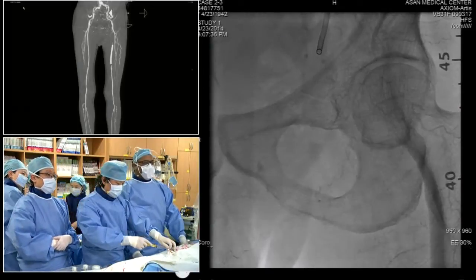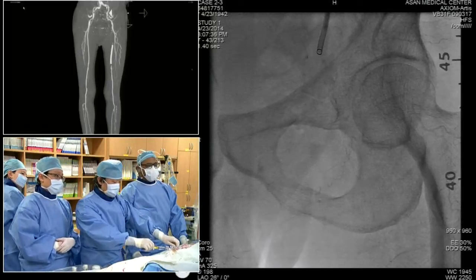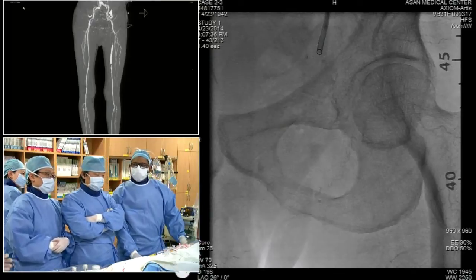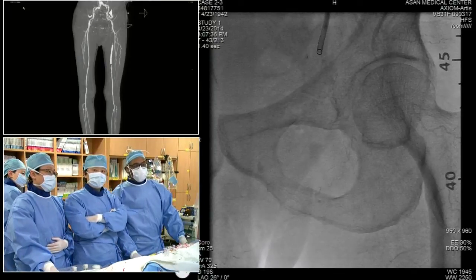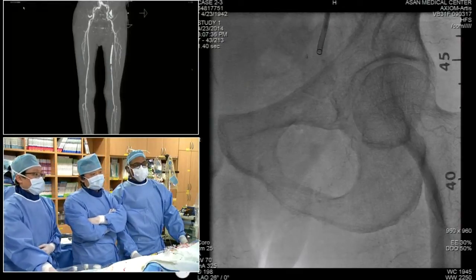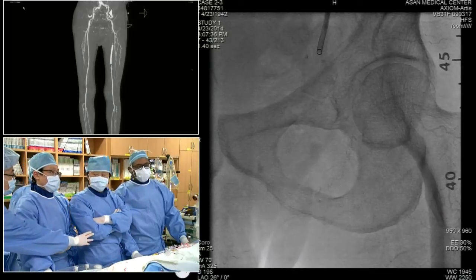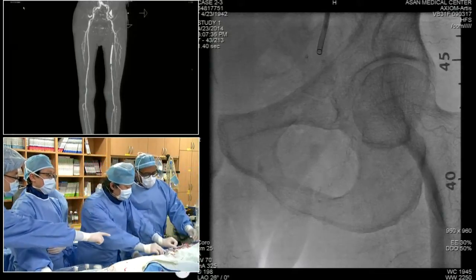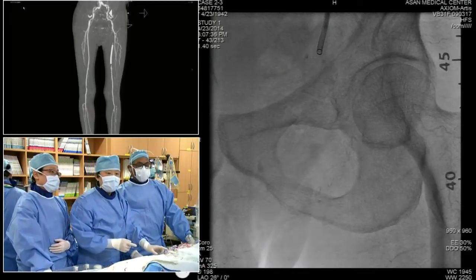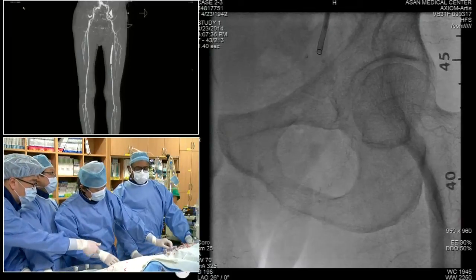I think backup in dealing with a long CTO is very, very important. Obviously, we want to get in the same plane as that nitinol stent, and that's going to be key. If we get subintimal and we cannot get in the intraluminal plane of the nitinol stent, then we're going to have some problems. And more problematically, we may have to, at a later date, bring this patient back for a popliteal retrograde stick in order to move forward.